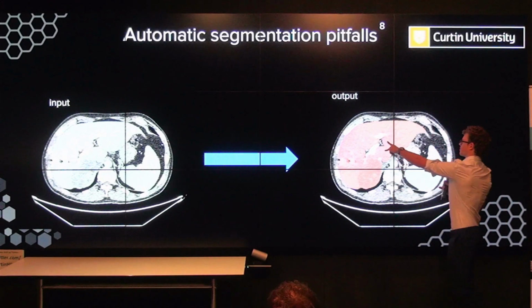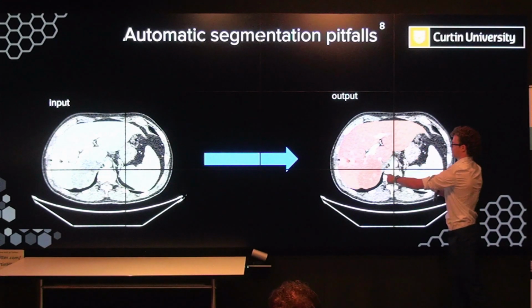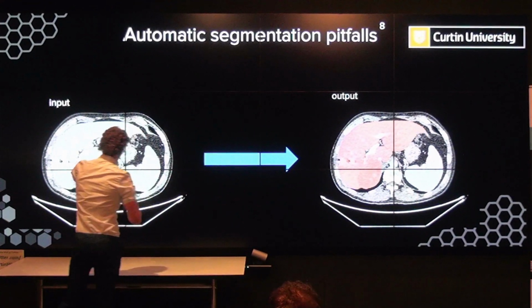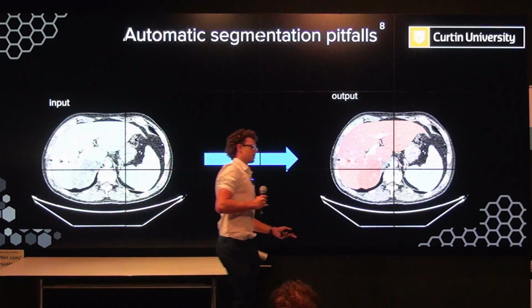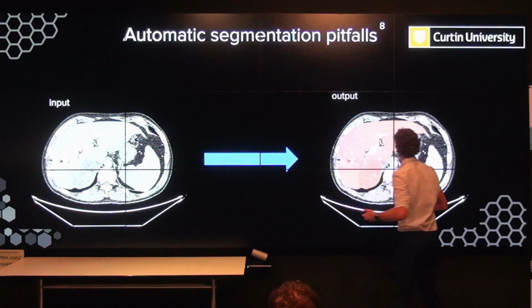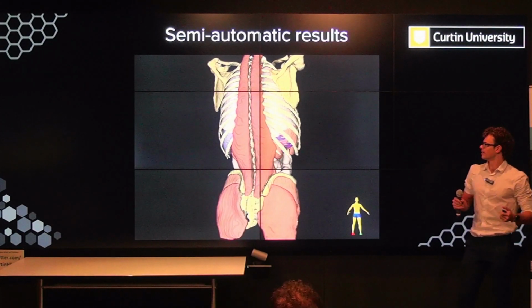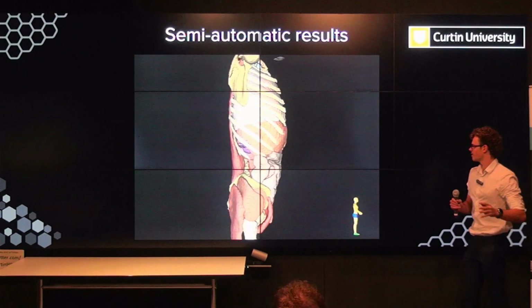You got the portal veins there. It recognized that that's not liver. However, in maroon, we have the liver, and that's our cancer there. We've got our cancer over here. It thought the cancer was part of liver. So I go, okay, automatic is not going to work. We need to do this semi-automatically. It's kind of scary being outsourced to a computer, you know, watch out radiologists, you're next.